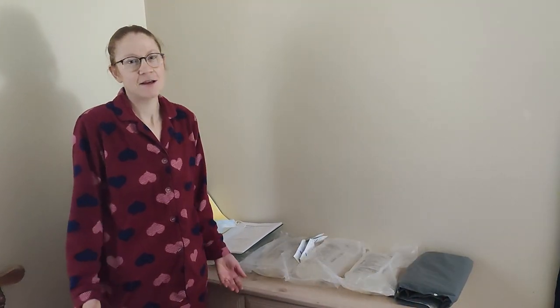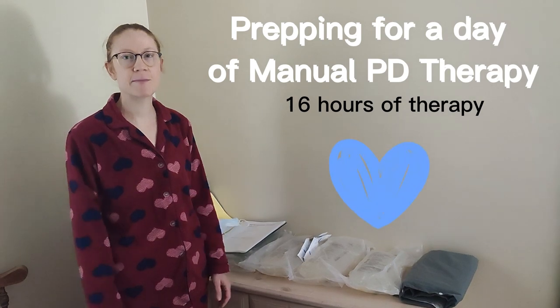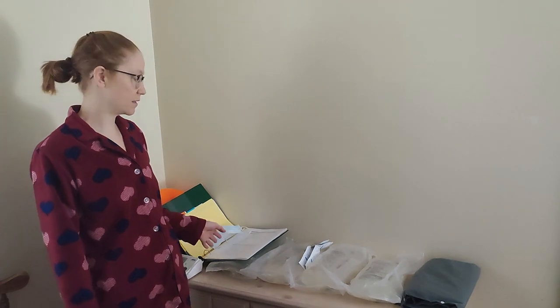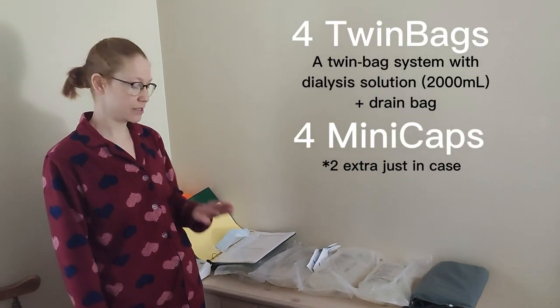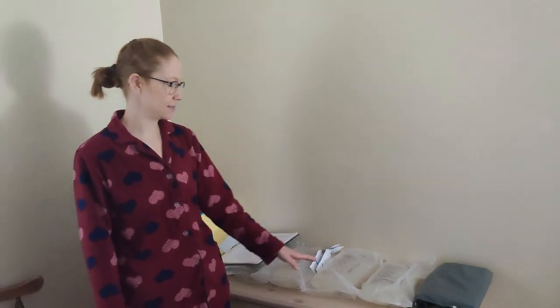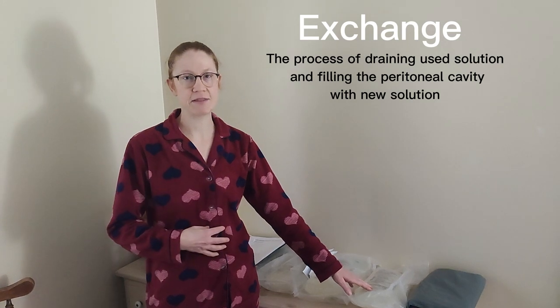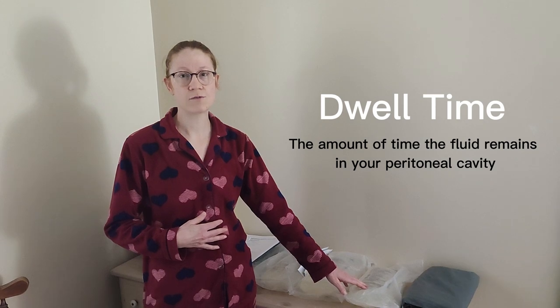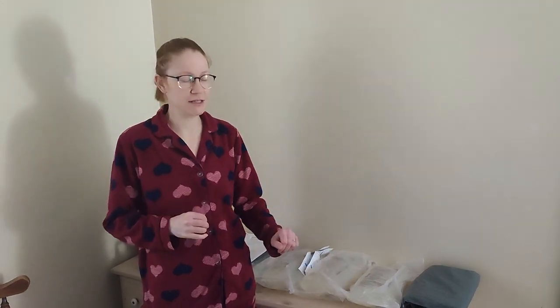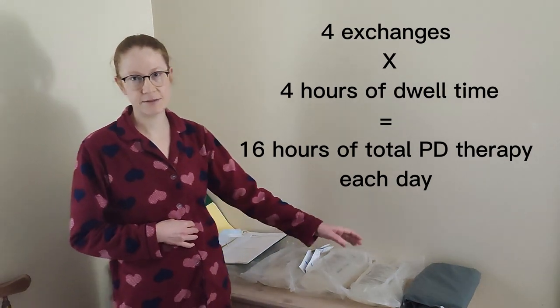Good morning. This video I'm going to show you what a day looks like doing peritoneal dialysis manually. At the beginning of the day I set out all the supplies I'm going to need. I do four exchanges, so you can see I've got four bags here. Each exchange, when I put the fluid inside me, they call it dwell time — the fluid sits in your peritoneal cavity for four hours. That's for me; you may be different. So the whole therapy takes about 16 hours.